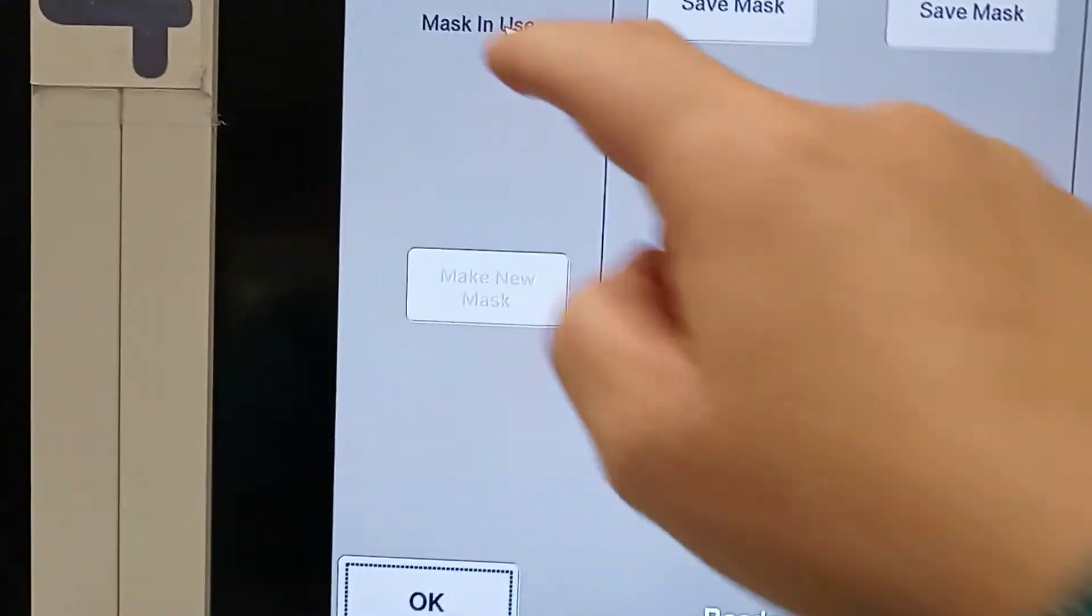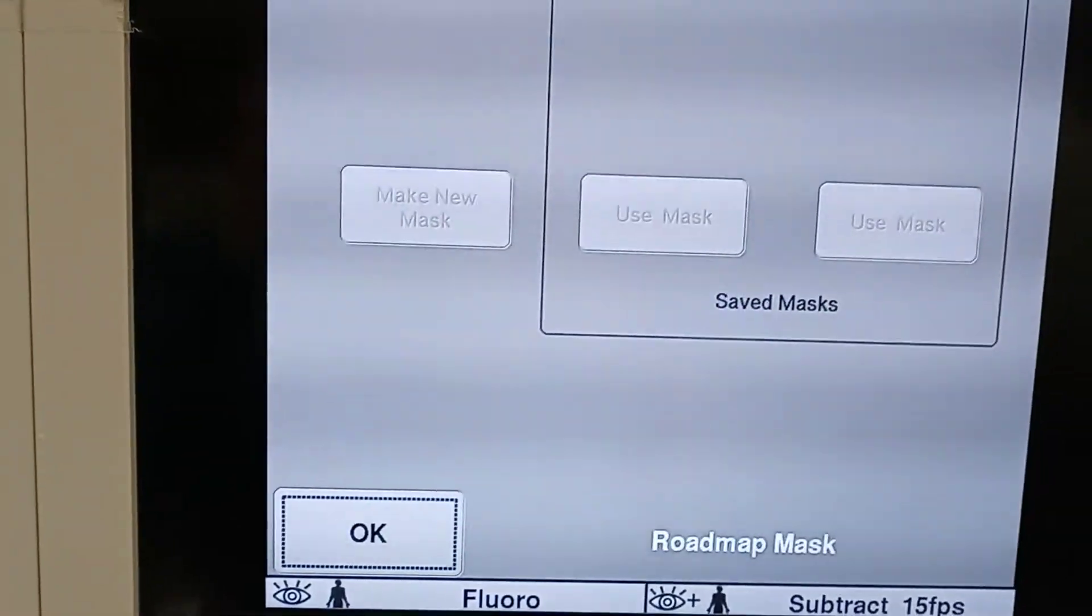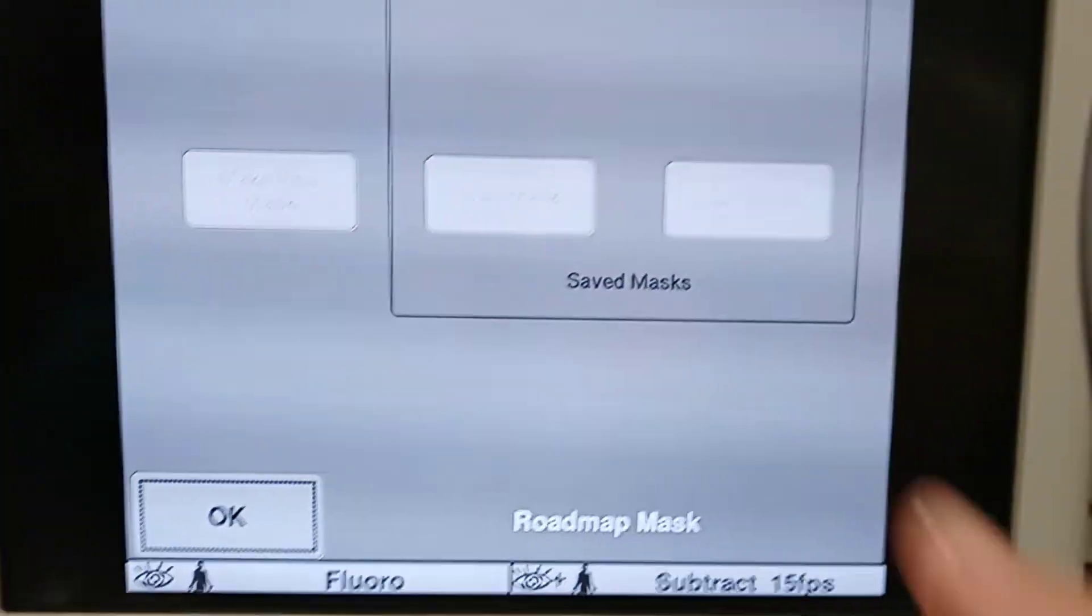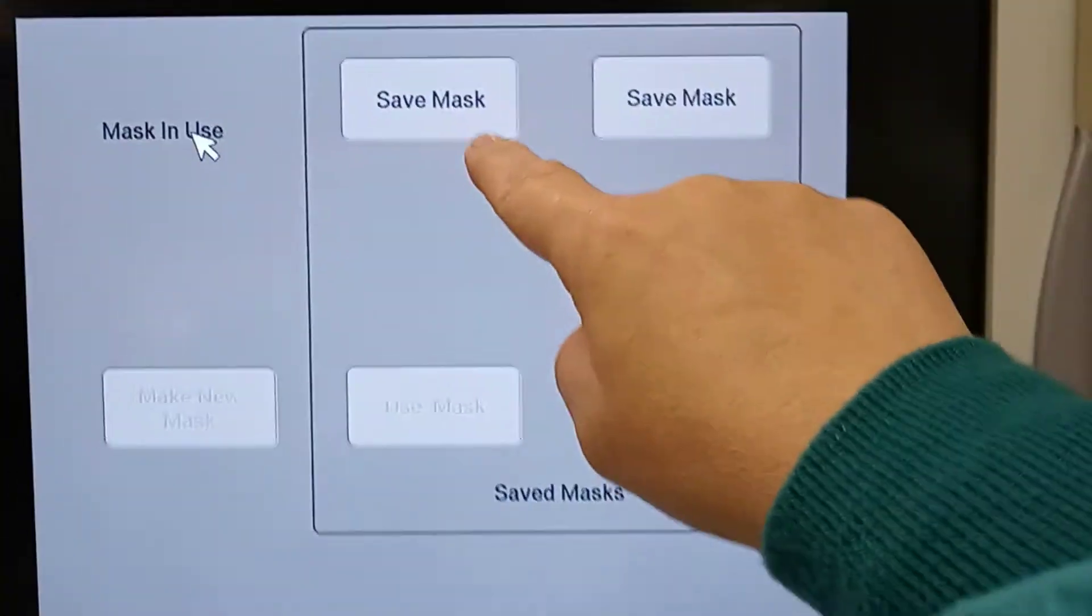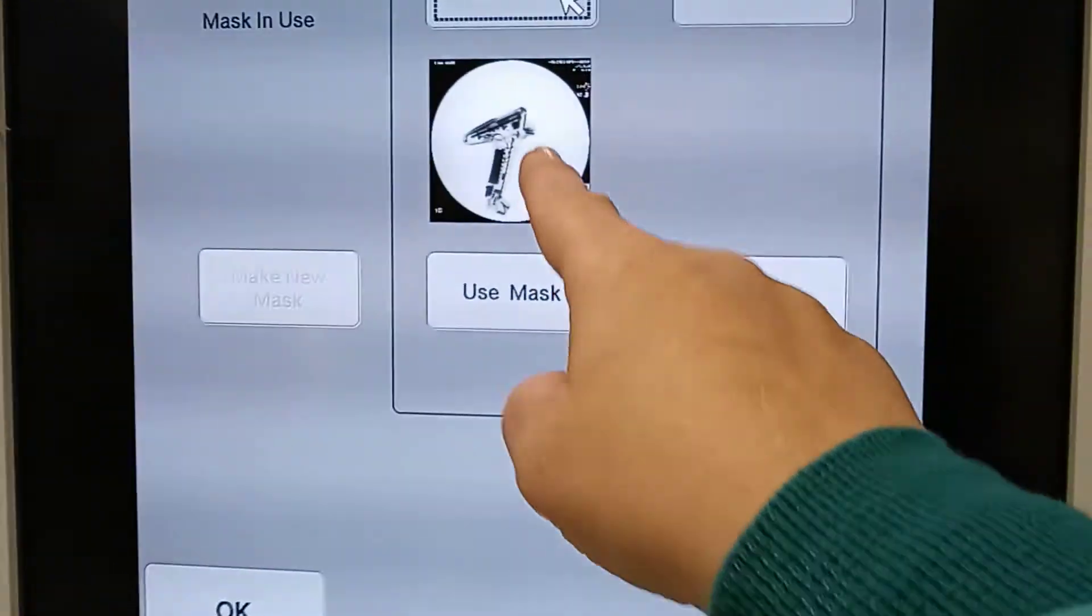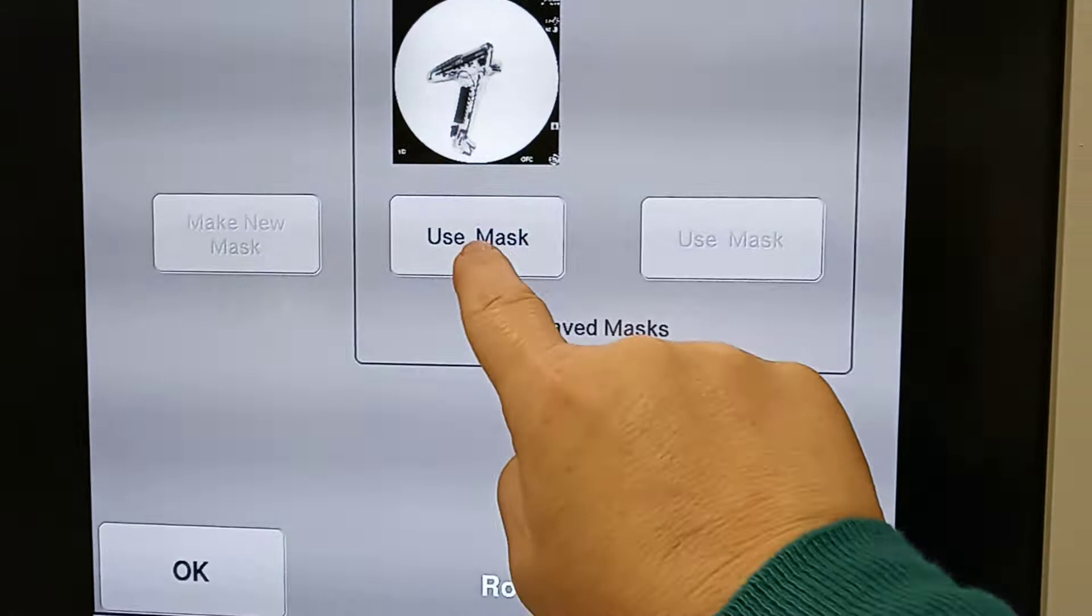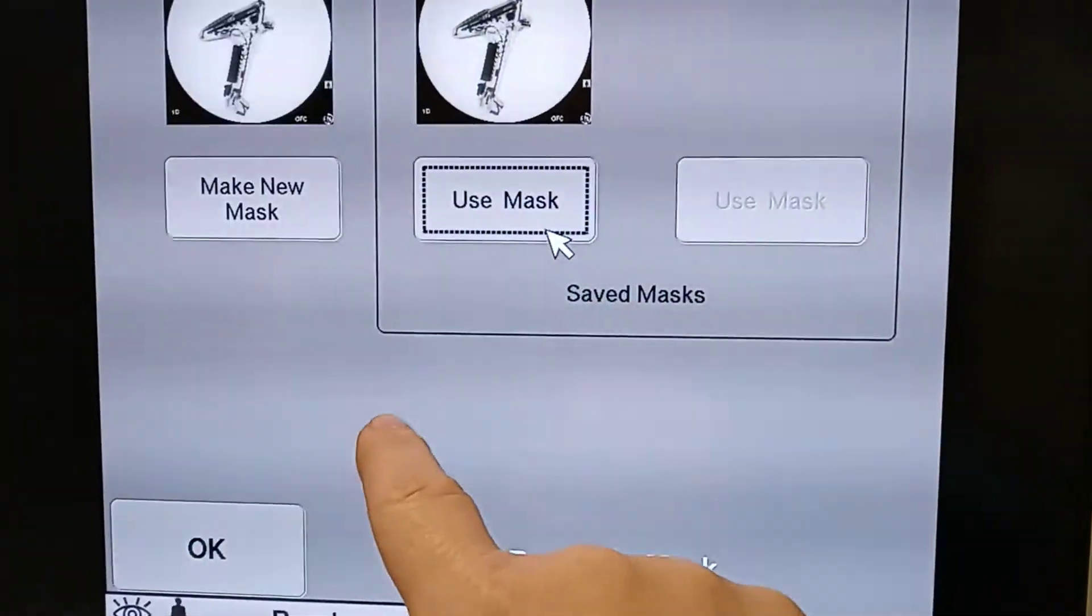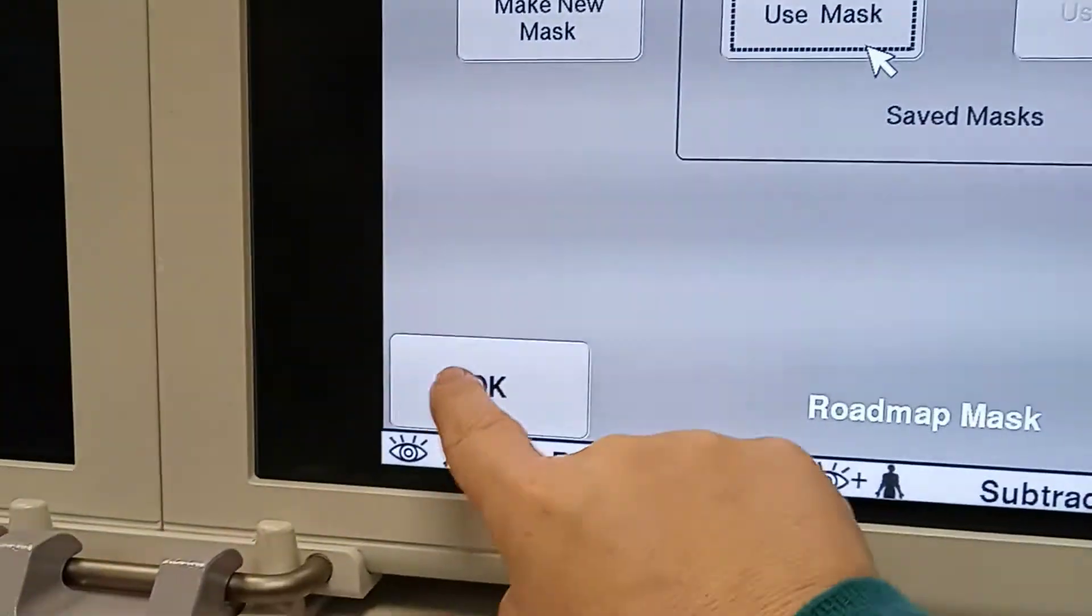And then hit Roadmap Mask. Save Mask. It pops up here. Use the mask. Hit OK.